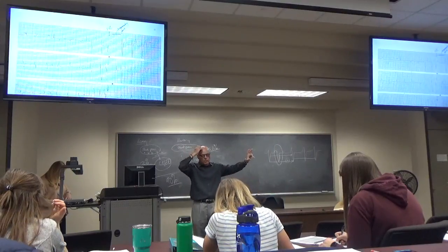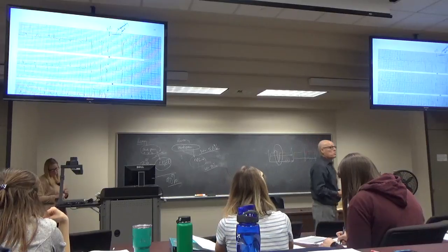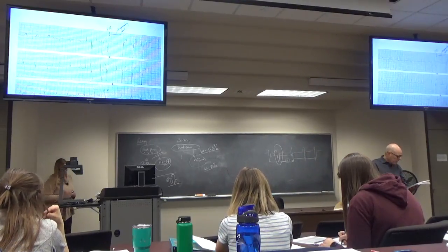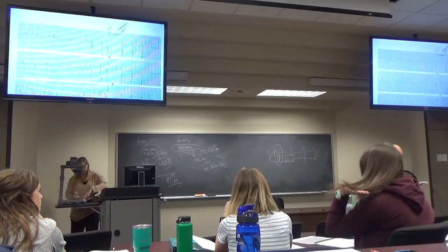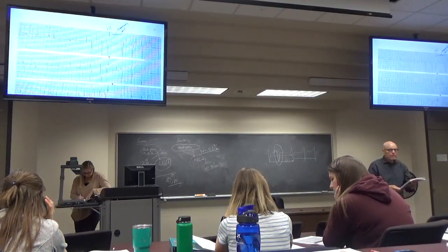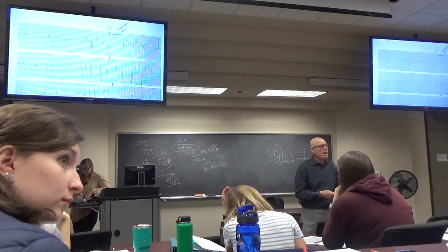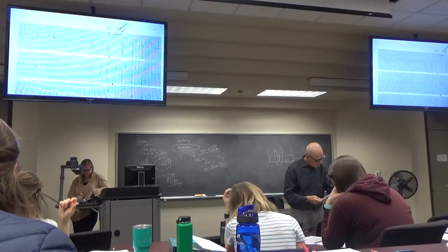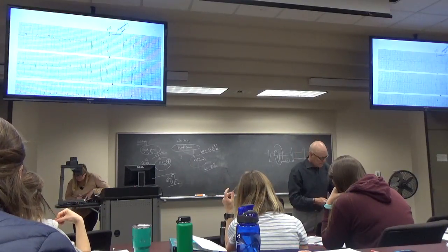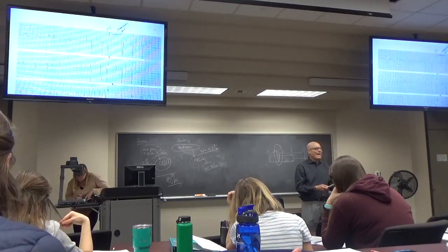Anybody not understand why this is a left bundle branch block? It's a left bundle for everybody. It may or may not be a first degree AV block. In 2, 3, and aVF, is the P wave enlarged? Is the what enlarged? The P wave. Yeah, it's a little bit wide.